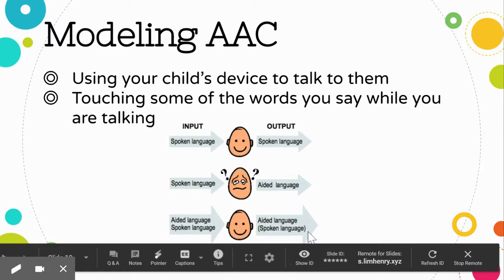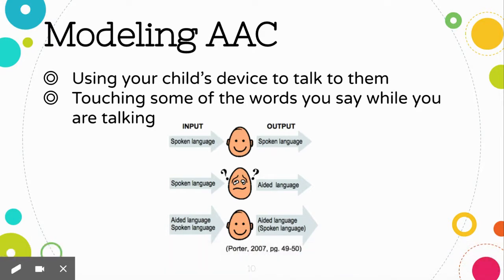There's lots of research to support that using an AAC device does not deter the development of spoken speech. Children will still continue to develop their spoken speech, and people are always going to communicate in whatever is the fastest and most efficient way possible, and that's usually spoken speech. So as their spoken speech hopefully continues to develop, then they will use that. But if it doesn't, they have the ability to continue to use the AAC device.